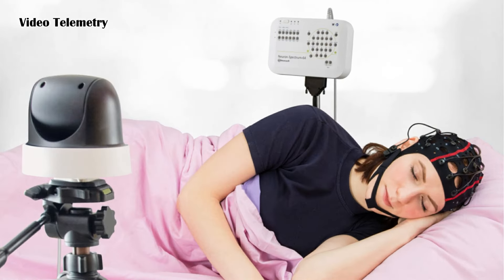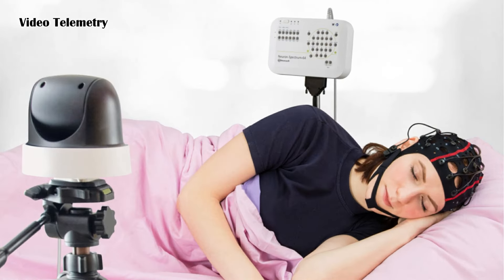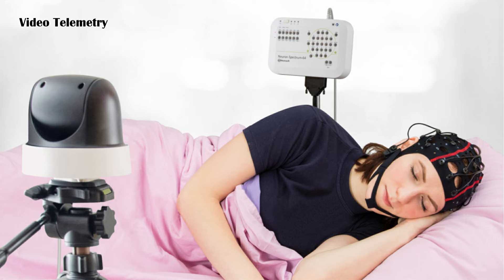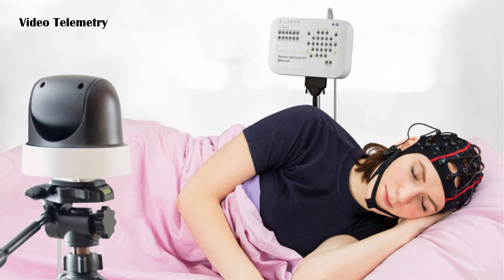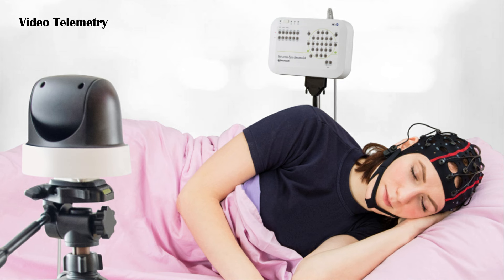Video telemetry is another type of electroencephalogram. It is a special type of EEG where the patient is filmed while the recording is taken. This test provides more information about brain activity and is usually carried out over a few days while staying in a purpose-built hospital suite.